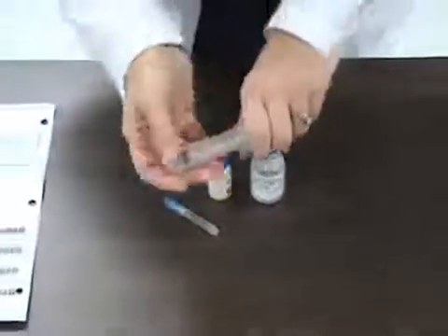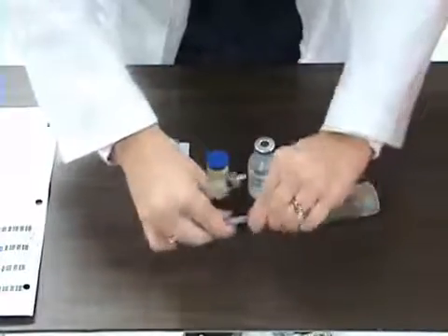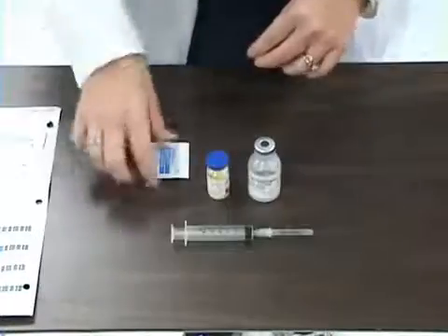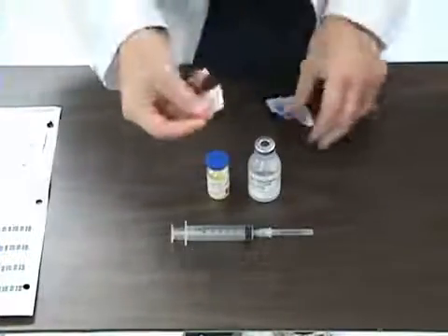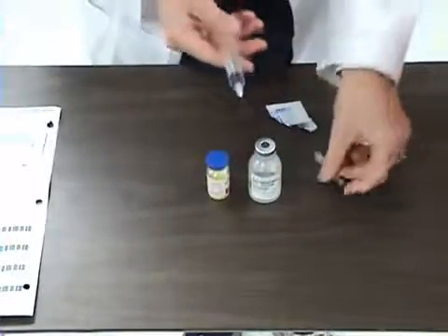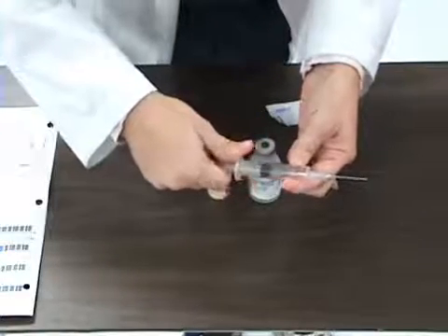I will attach the needle to the syringe. I will swipe the vial with an alcohol prep. I will withdraw 5.6 ml of normal saline for reconstitution.